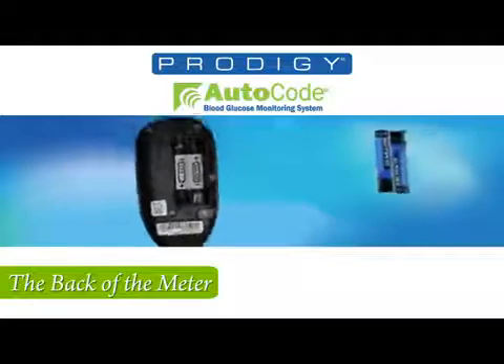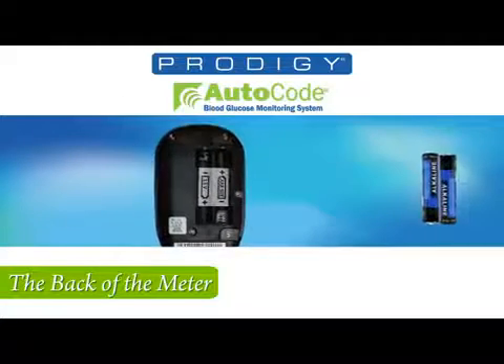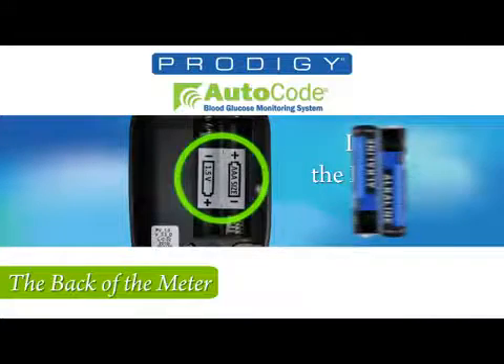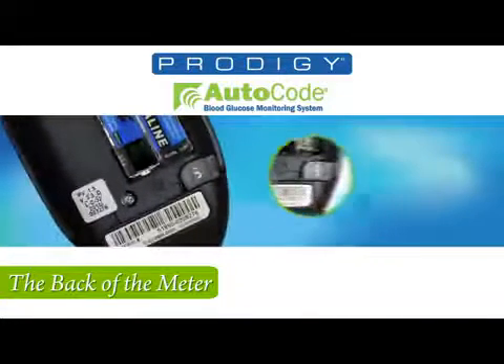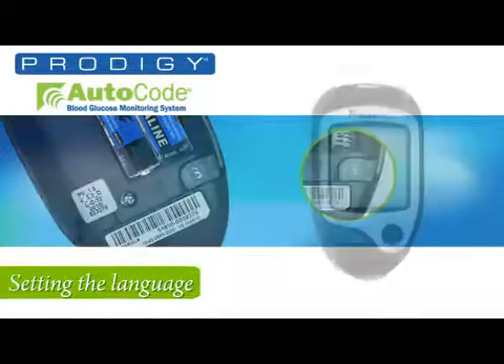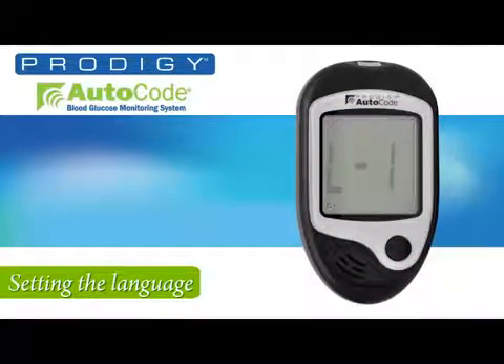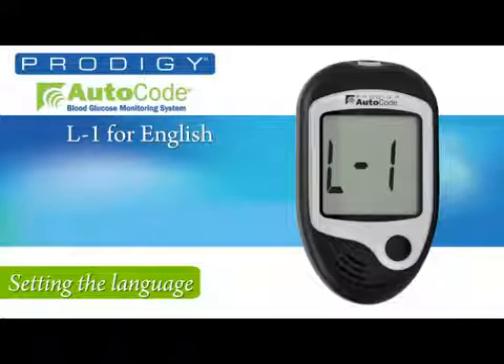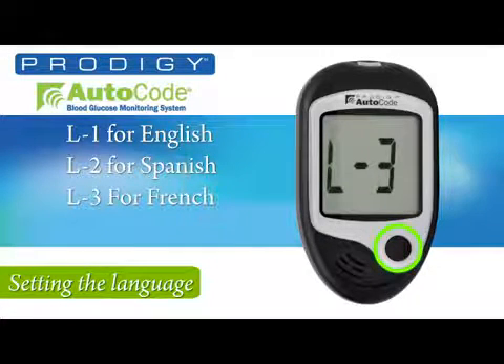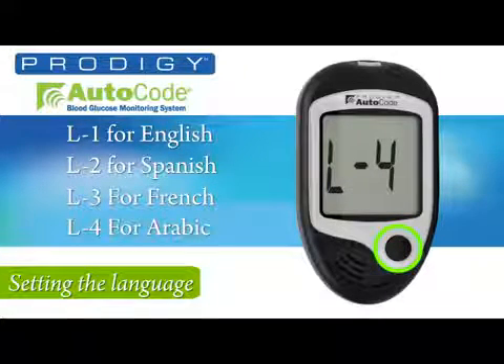By pressing down, you'll open the battery compartment and also see the set button you'll be using for setting the meter. Start by inserting the batteries in the back of the meter. The sticker in the battery compartment ensures the batteries are oriented properly. With the batteries installed, press the set button and flip over the meter without reattaching the back plate. Use the M button on the front to select the language you want: L1 for English, L2 for Spanish, L3 for French, and L4 for Arabic.